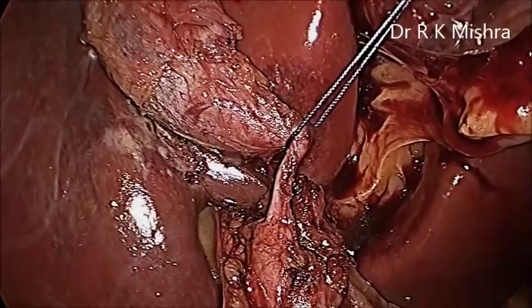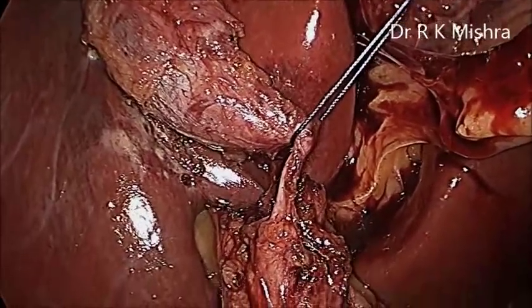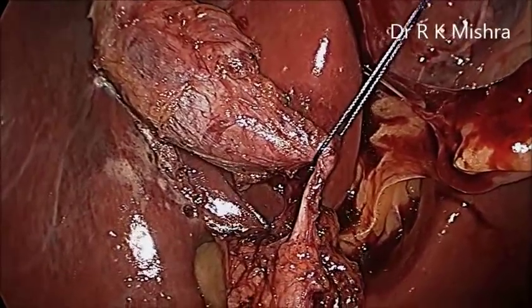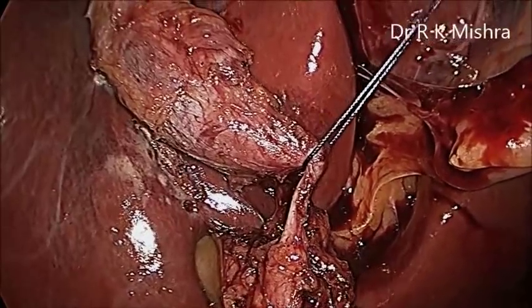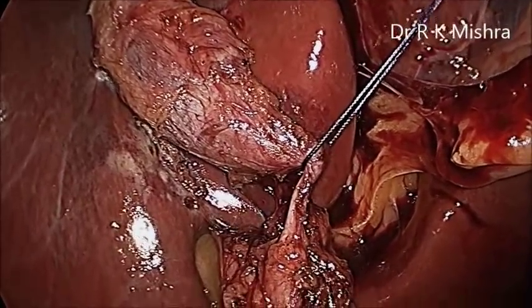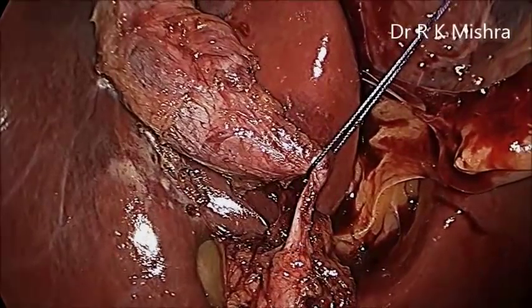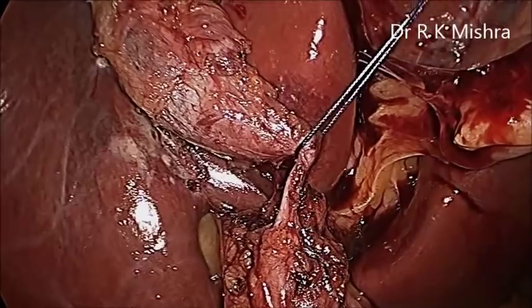This is the time taken in tying the knot. And this part also we have not edited. So it's a complete continuous shot. And once the knot is tightened, now you can push it with the help of the knot pusher. Two reducers have to be used here. One is 10 to 5, another 5 to 3.